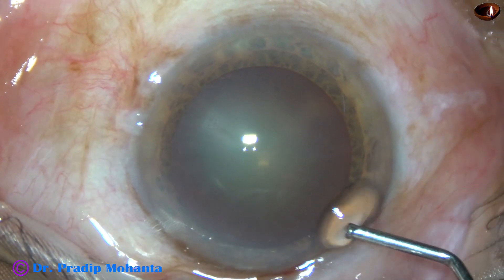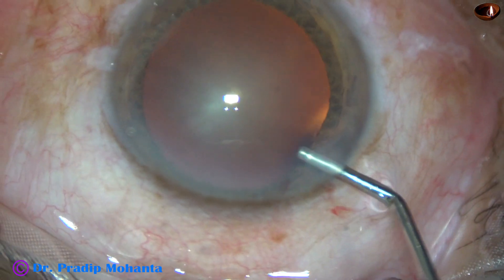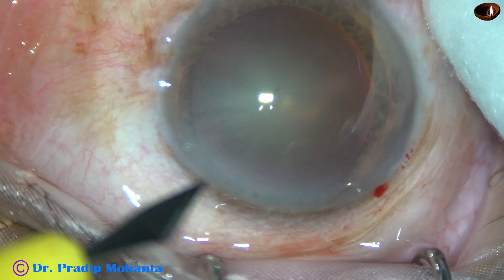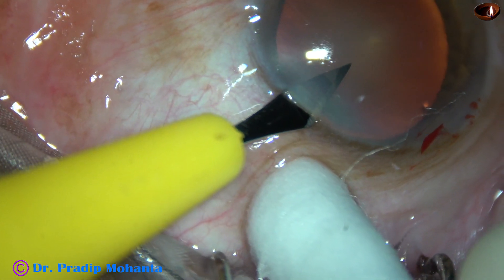By this time, the main incision and a sideport on the right side of the main incision has been made. Viscoelastic has been injected into the anterior chamber. And now this is another sideport on the left side of the main incision.